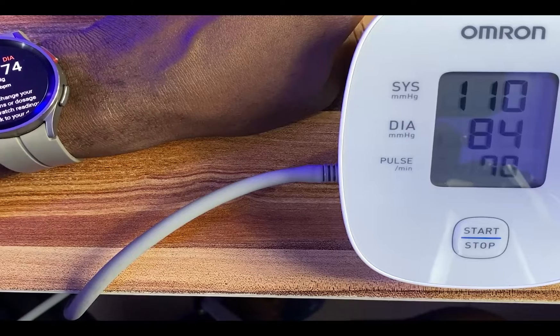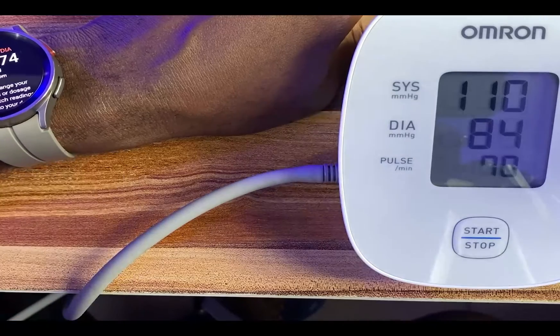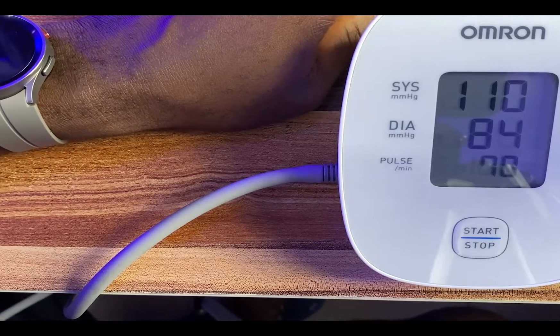Please note that this is not medical advice. You should not take any medical action based on the measurements you get from the watch without seeking the advice of your doctor or any qualified healthcare professional. This is just for general information purposes only.